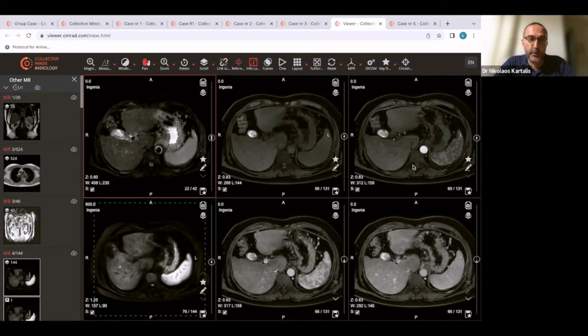If you would decide to go for the MRI, then definitely Primovist is not the best option to start with, because the dynamic patterns and the amount of gadolinium used is much less than the extracellular agents. So it's preferable to go for the extracellular and get the optimal enhancement part in the periphery.